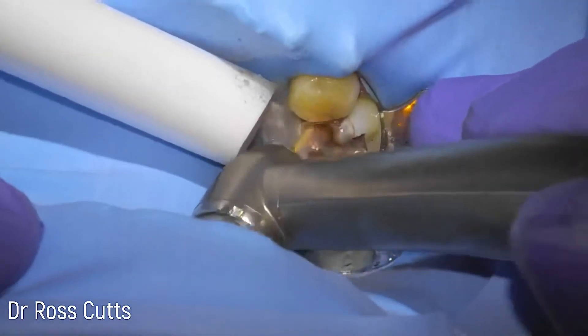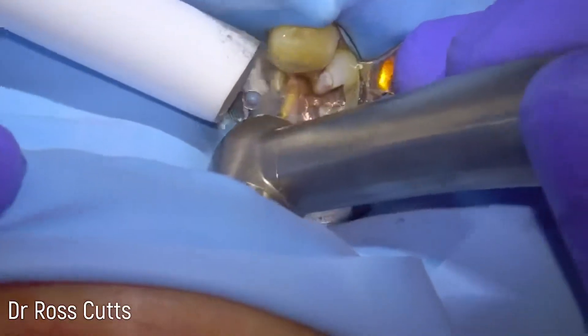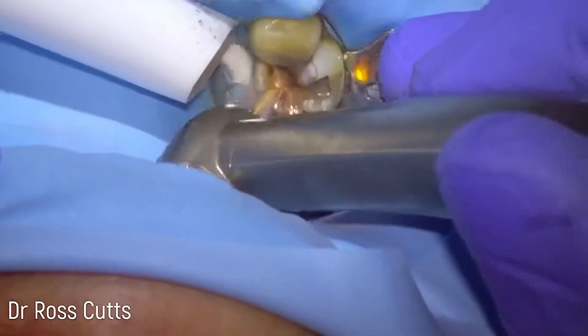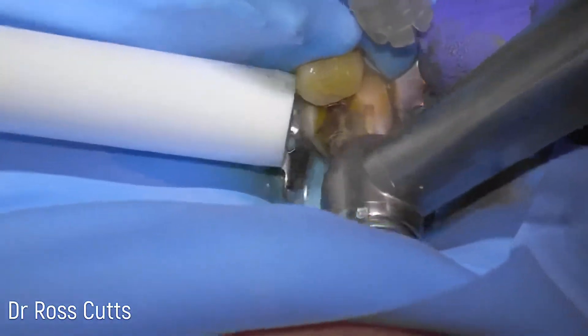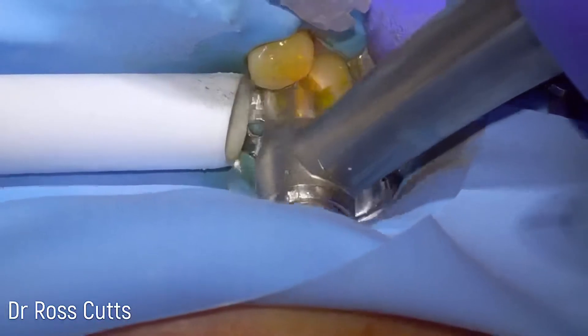We try and take these out in pieces so as to minimise aerosolisation of the old silver filling. Lots of water and high-powered suction being used, just carrying on gradually taking it out in chunks.